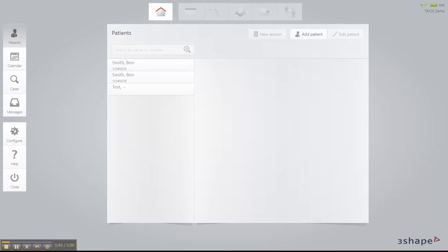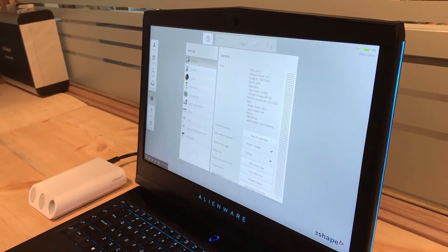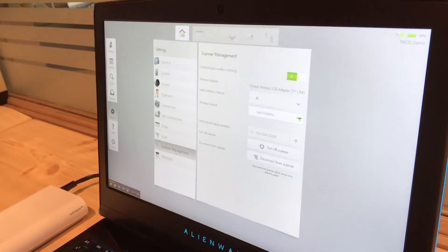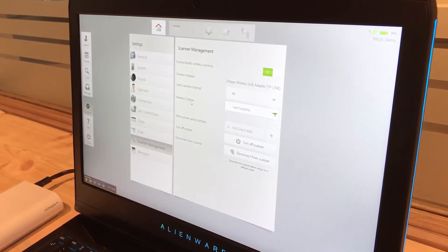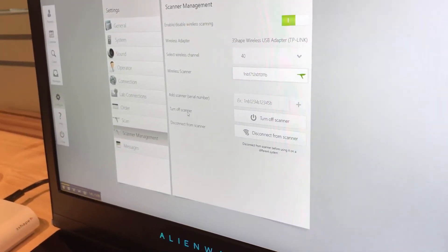The version of software we're using is brand new — it's 1.4.7.2 — and this version is used for the new Trios wireless wand. Outside of that, there are some new updates coming, but for right now it enables this wand to work wirelessly. It also has some additional features such as a new scanner management icon. This icon lets you select the wireless channel, defines the wireless adapter, and shows the scanner serial number. It also has features for adding a scanner, turning off the scanner, and disconnecting the scanner.